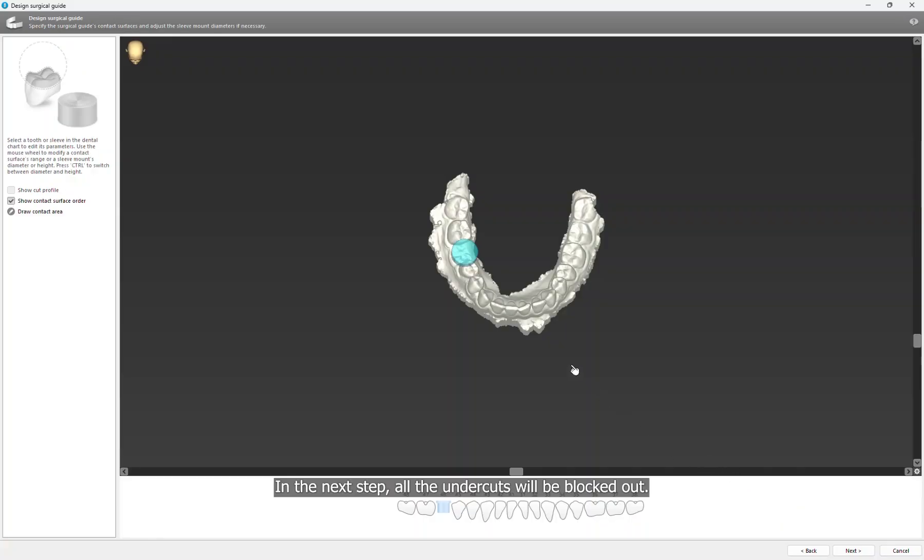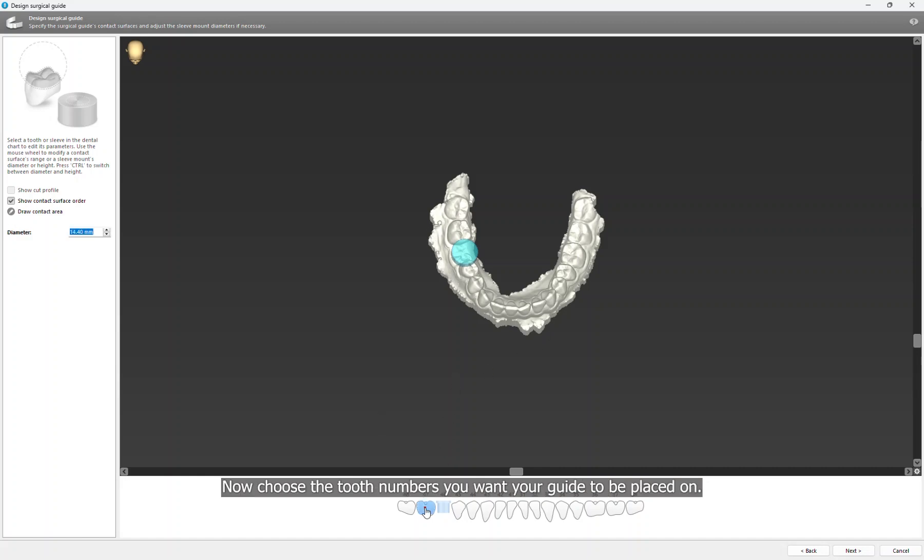In the next step, all the undercuts will be blocked out. Now choose the tooth numbers you want your guide to be placed on.